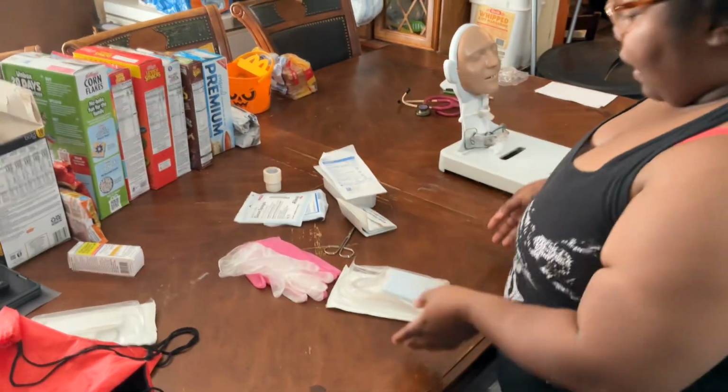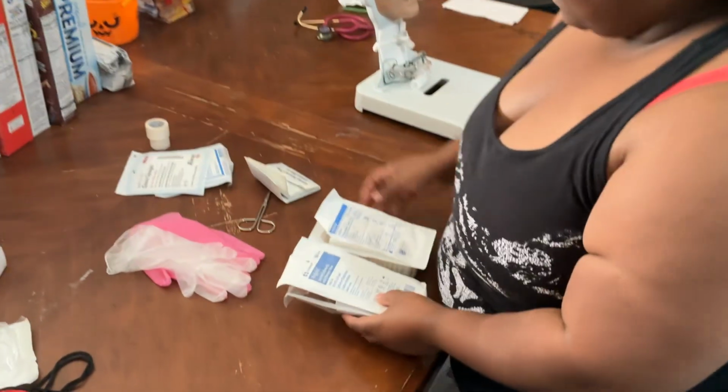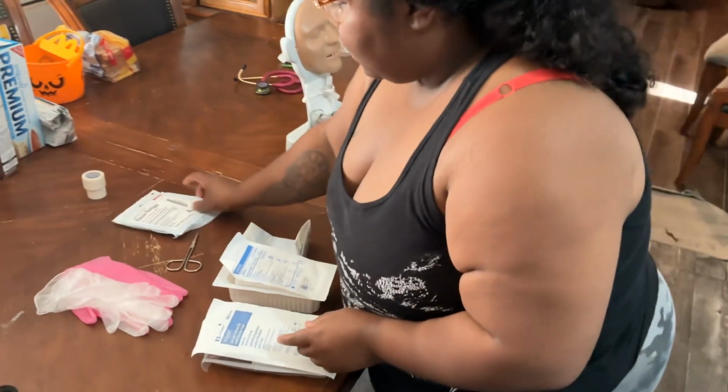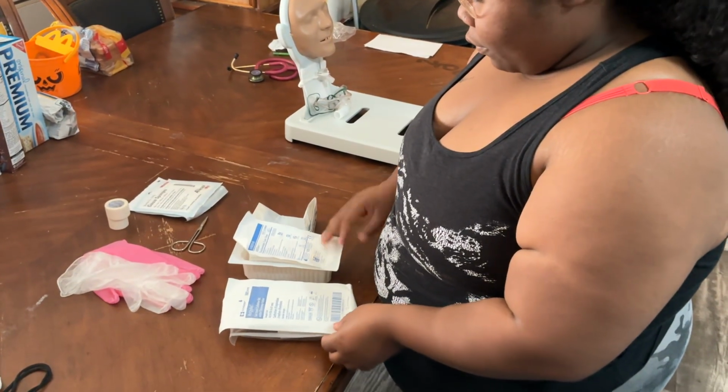If it were to have been used, I would unscrew the cap and I would pour a little bit out before I did use it, and I would keep it back up and use it. But if it hasn't been used, I would date it with today's date. Just want to verbalize that. Alright. So I'm going to gather my material. I'm going to check the expiration on it. All my material is within date. Nothing is expired. Everything is within date. Alright. Looks good. I do have some tape, scissors, and an extra pair of gloves for what they're needed for.